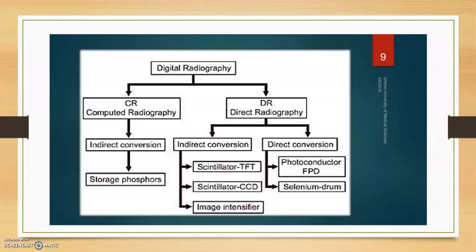The indirect capture causes resolution loss sometimes because of the scintillators. Direct capture only uses a photoconductor and has more uniform detection ability over indirect. So with a facility that's choosing DR, direct capture is the way to go. The most advanced DR detectors have automatic beam detection, which capture more latent data and have even more dose efficiency accuracy over CR.